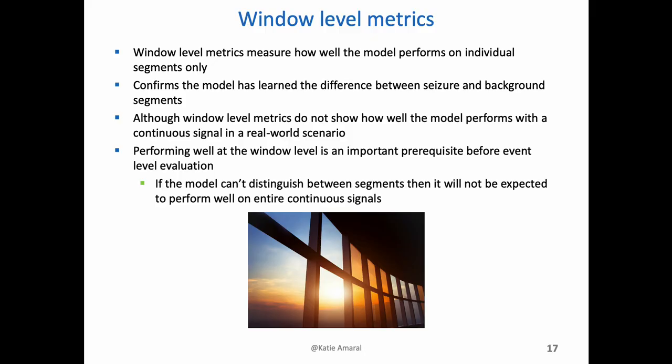Window level evaluation also doesn't capture the false alarm rate, which is important to minimize for usability. With that said, it's still very important for the model to perform well at the window level, and it is a necessary prerequisite before proceeding to event level evaluation. This is because if the model can't distinguish between segments, then it certainly won't be able to perform well on entire events.